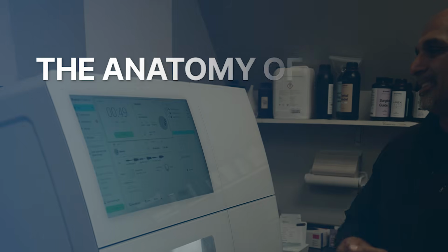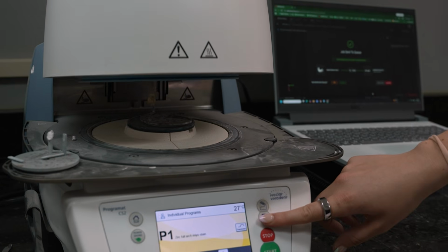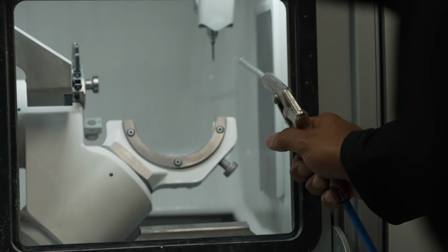Let me walk you through the anatomy of a dental lab, from everything from A to Z, okay? Number 1, it's your ability to capture the digital information. I know that's not lab equipment, but that's chairside. If you're not doing digital impressions, that's step 1. If you're not doing digital impressions, what world are you living in at this point in time? But the easiest and most common starting point is going to be chairside CAD/CAM milling. Okay, that's your CEREC machine, your Glidewell fast mill, different things like that allow you to make single tooth crowns that same day within an hour for your patient.